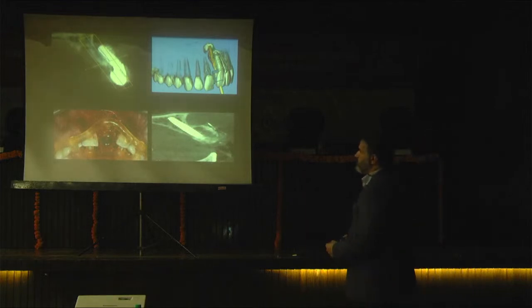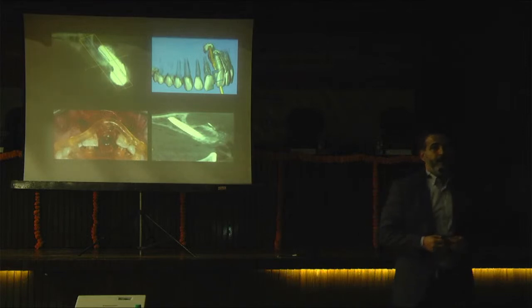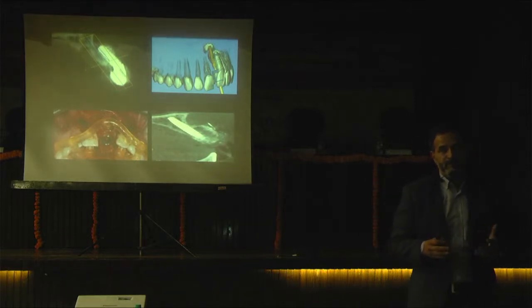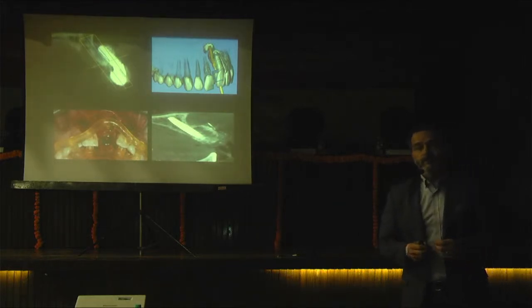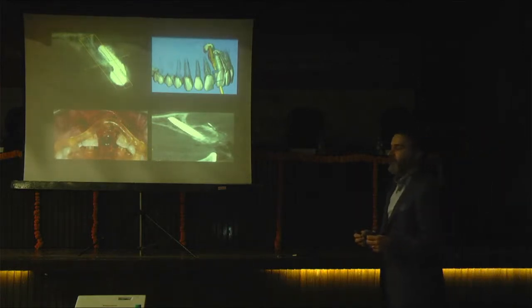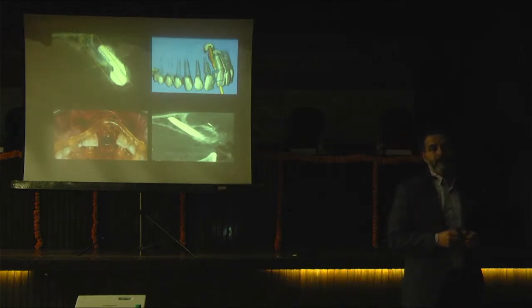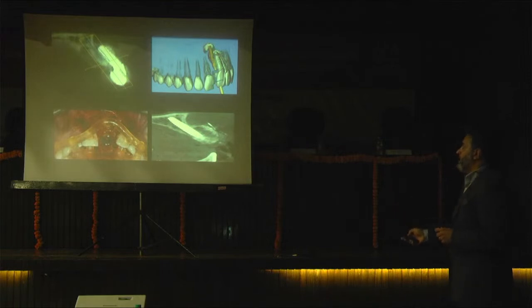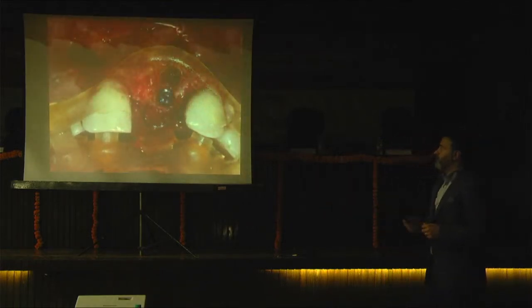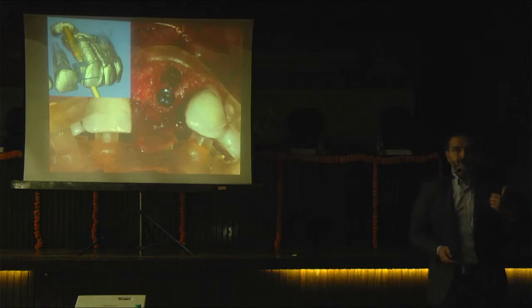I told my patient to take the implant out first. After that, I don't have any chance to place an implant with freehand surgery, because I'm not so lucky, so we have to make a guide, we have to use guidance. After that, I wanted to share the picture with you. This is the new implant, and this is the implant which was placed 5 or 6 years ago.